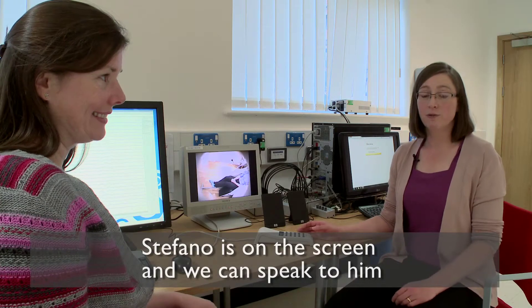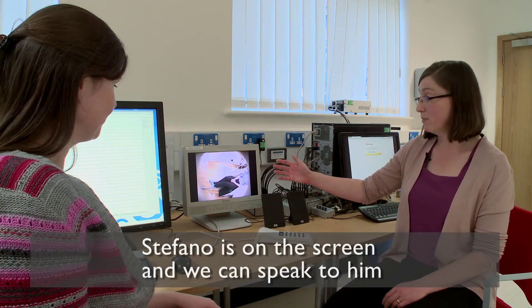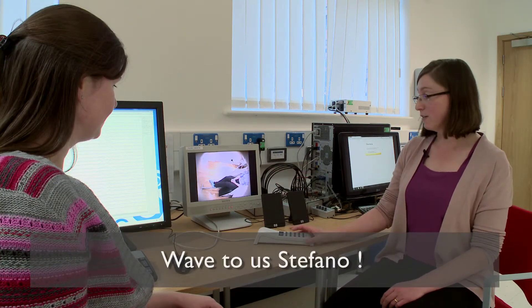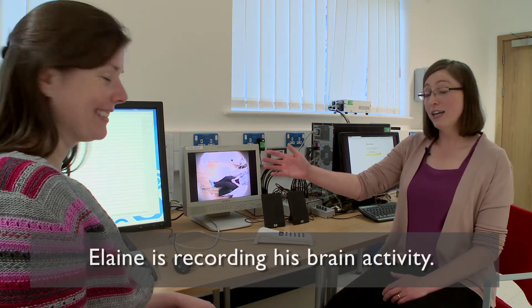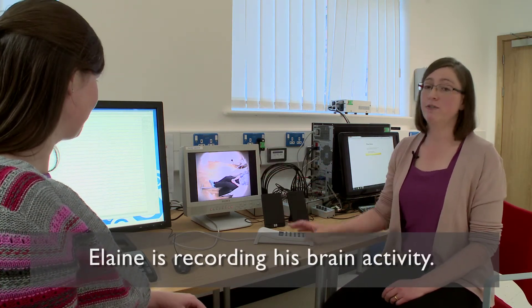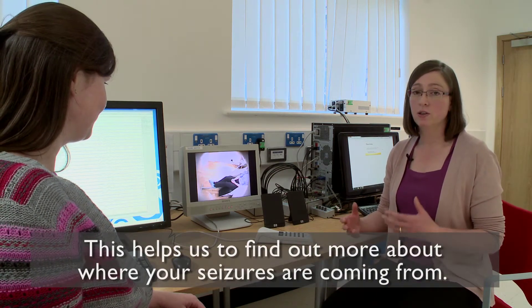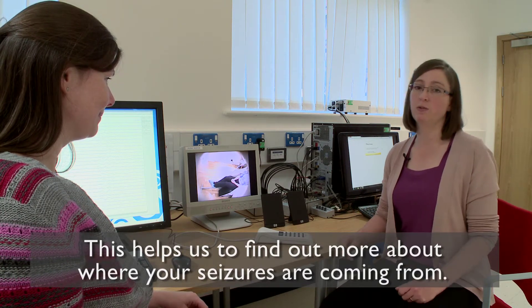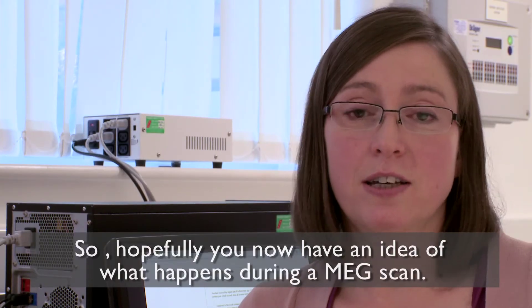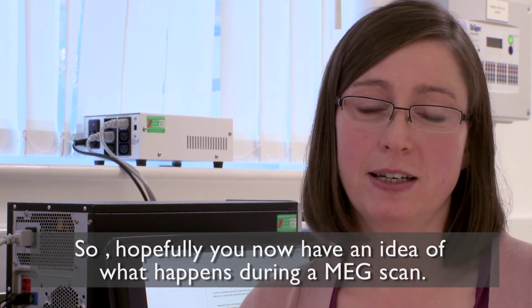We're back over at the desk now, and from here we can talk to Stefano through this intercom and we can see him on this video screen. On this computer over here, Elaine is recording Stefano's brain activity, and it's this recording that we can use to find out more about where in your brain your seizures may be coming from. So hopefully this gives you an idea of what will happen when you come to the Aston Brain Centre to have your MEG scan.